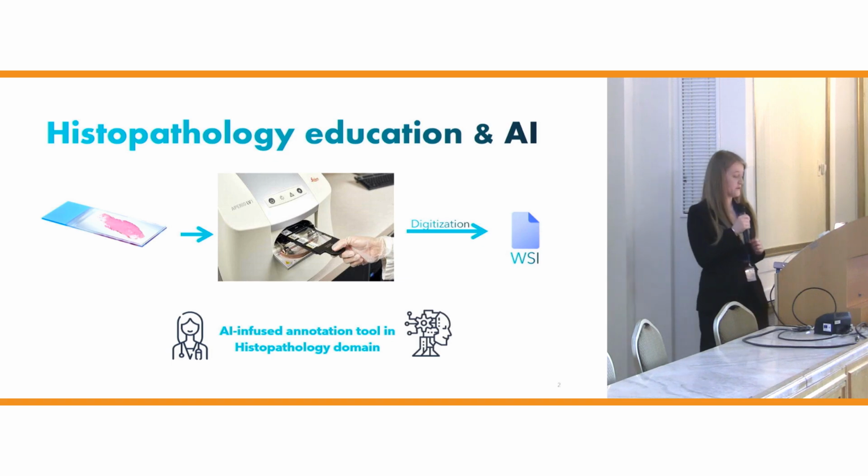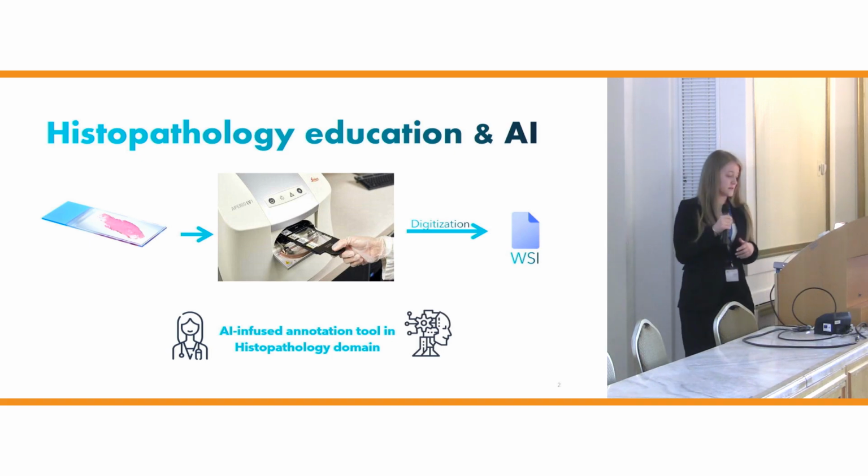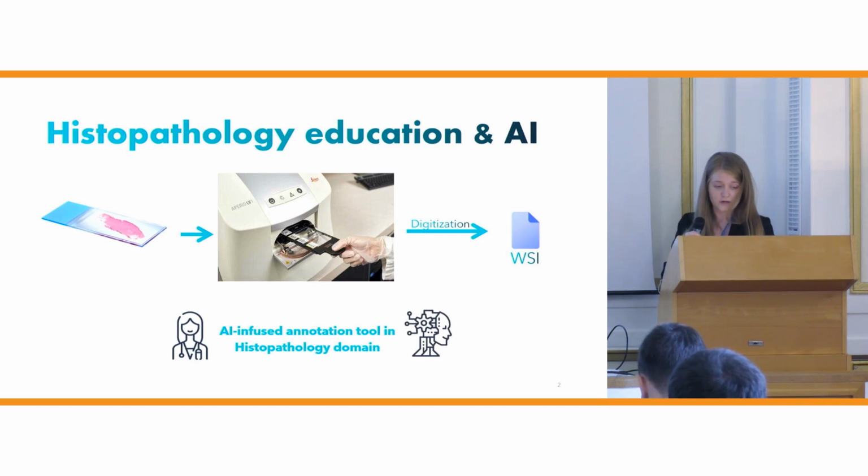So this type of image enables easier storage, sharing, and better analysis of the specimen, and enhances diagnosis and research capabilities. It's really important for students to engage with this form of histopathology, so the digital histopathology will become their standard in their future work.